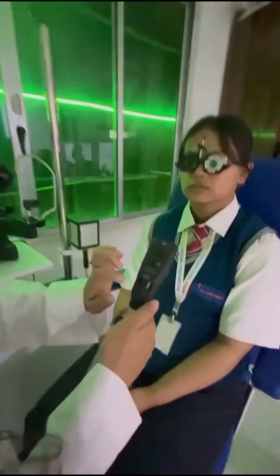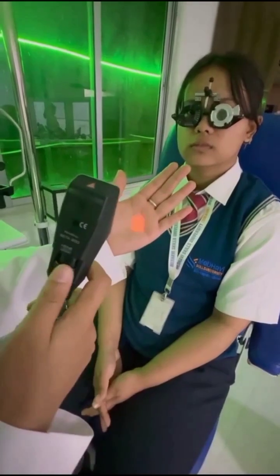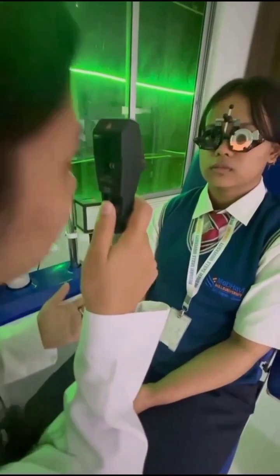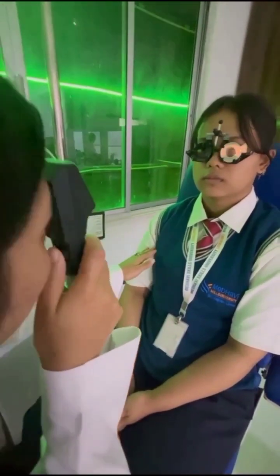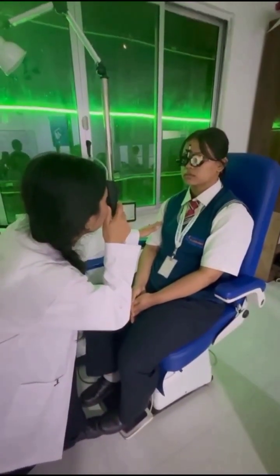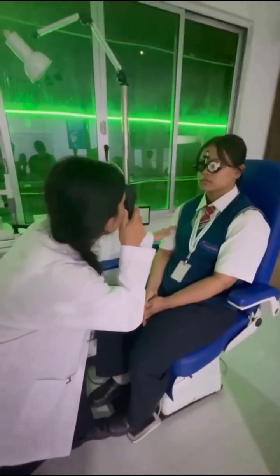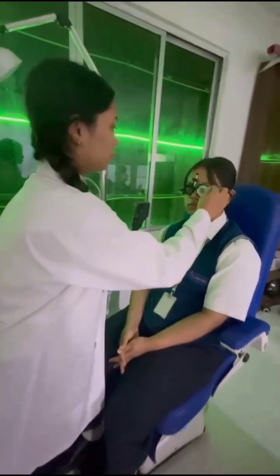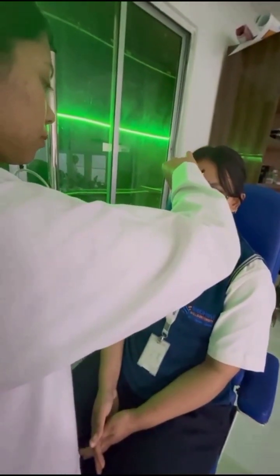These two are the main axes, and from the sleeve I am going to change the direction of the meridian according to need. Now I am projecting the light and observing the streaks. Now I did not see any movement, which means it is neutralized.